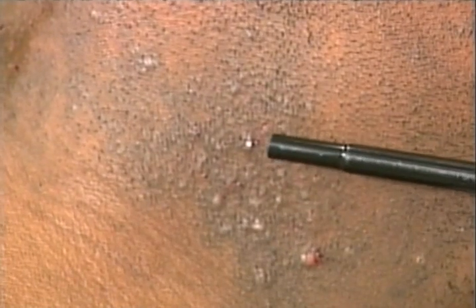With our work, along with the work done by Dr. Vic Ross, we've been very impressed with the results of the long-pulsed Nd:YAG laser for the removal of hair in dark-skinned individuals, and specifically with pseudofolliculitis barbae.